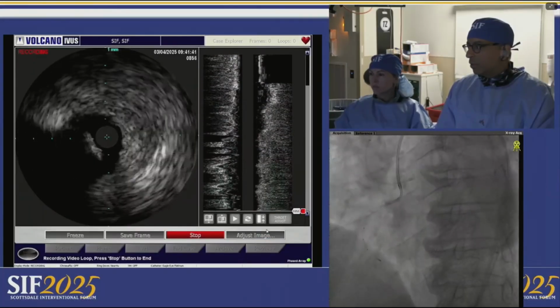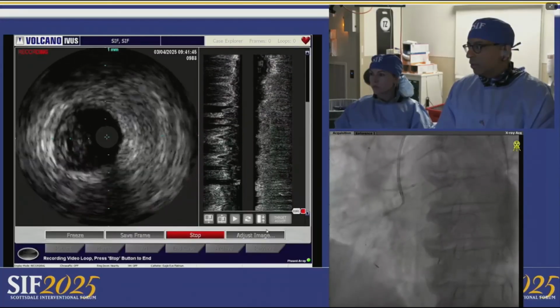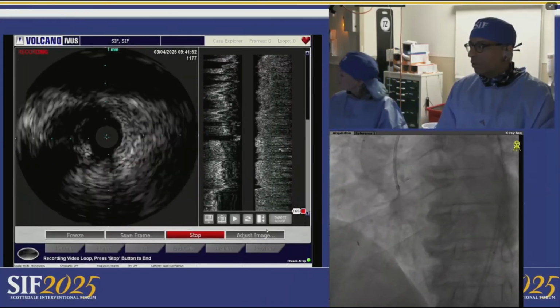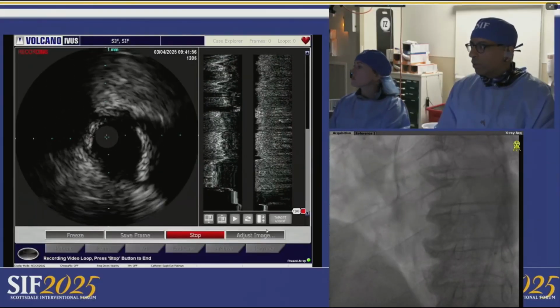Like right there, we have a nodule. Yeah, the area that you had to grab both ends of the externalized wire and shove the IVUS past, probably that. How do you manage distal vessel sizing in a CTO because of negative remodeling?